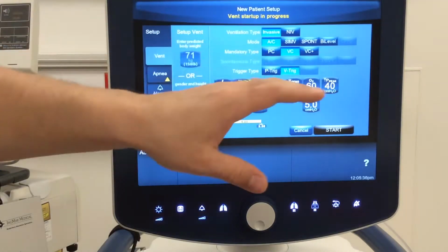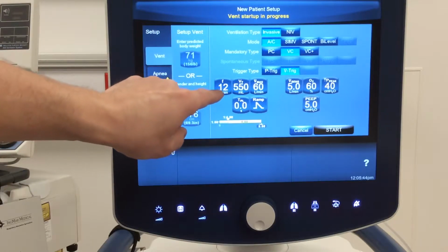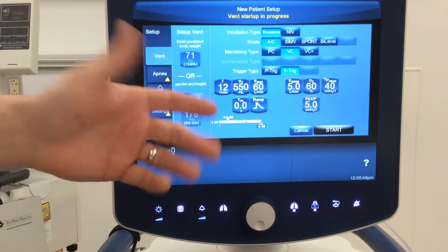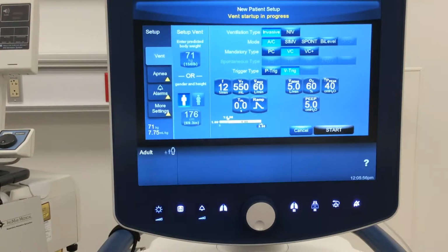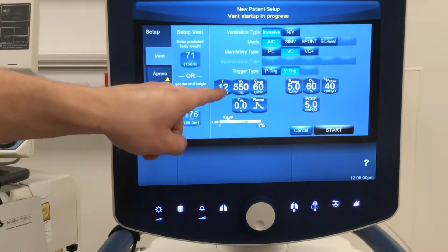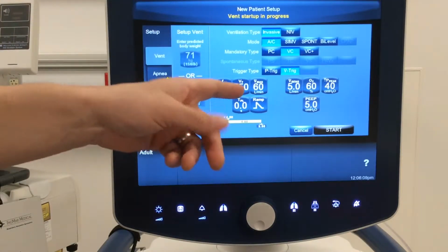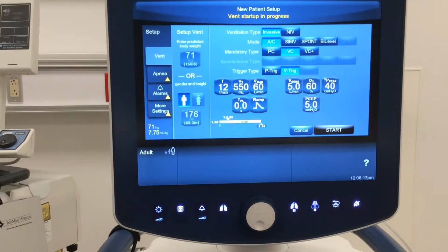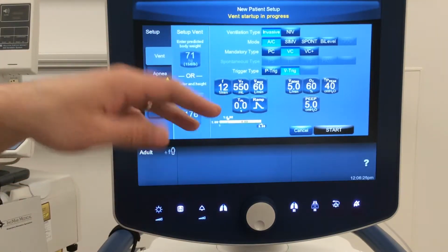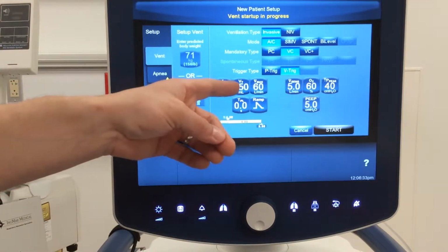Now, one notable thing that we'll get to with assist control is regardless of who triggers the breath. So if the ventilator does a time triggered breath because my timer goes off and it kicks in and gives a time triggered breath to this patient, it's going to be 550 mils at 60 liters a minute. All right, it's going to take 1 second to do so. If my patient decides to trigger a breath, and they pull in that 5 liters, the ventilator kicks in, they're still going to get the same exact breath. It's going to be 550 mils. It's going to be 60 liters a minute of flow, to deliver that 550, regardless if that patient needs that much or if they need more. And it's going to take 1 second to do so. So the hallmark thing about assist control, CMV, whatever you want to call it, is that it doesn't matter who starts the breath, the same result occurs. So all this patient has to do is start that initial little inspiratory effort, the machine's going to kick in, and it's going to give them a mandatory breath.